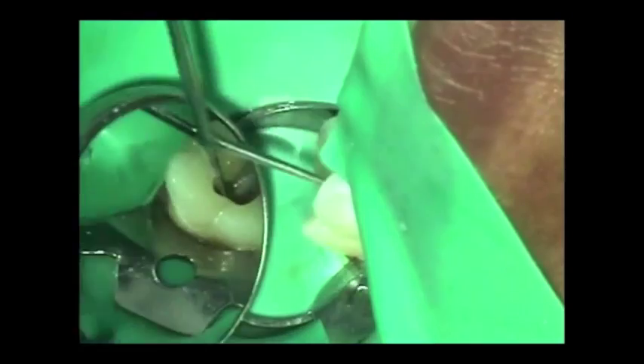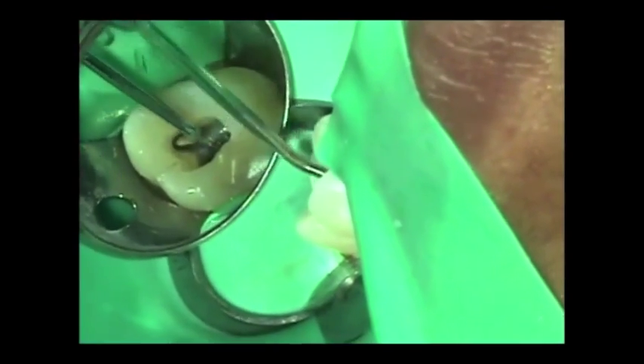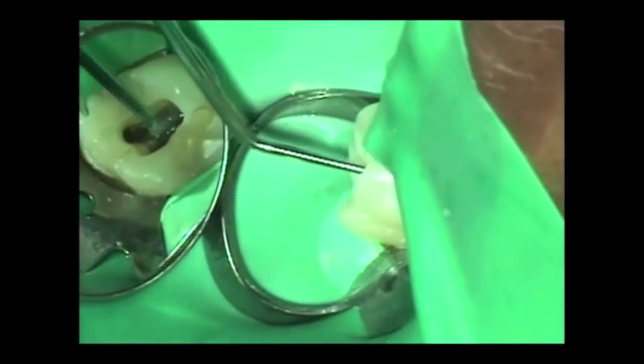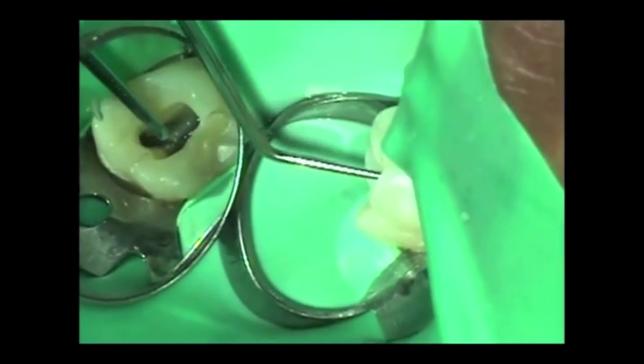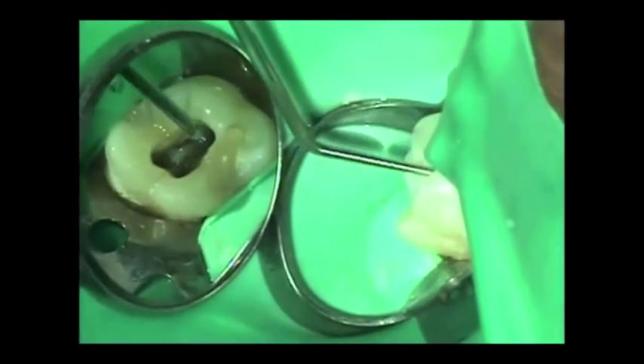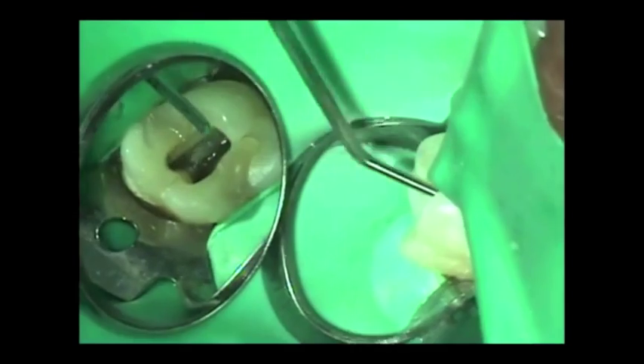We've got the DB canal here, we've got the palatal canal, and we've got the MB2. We're going to see if we can find an MB2. I may be able to find it, I may not be able to find it. Most of the time they exist, sometimes they don't. But we're going to exhaust our efforts to try to find it.